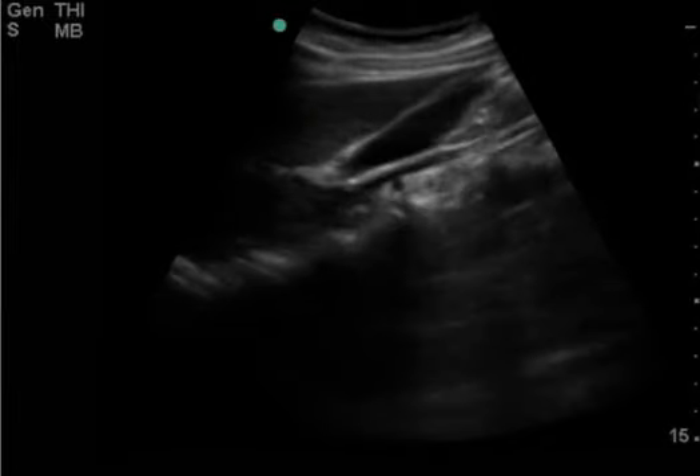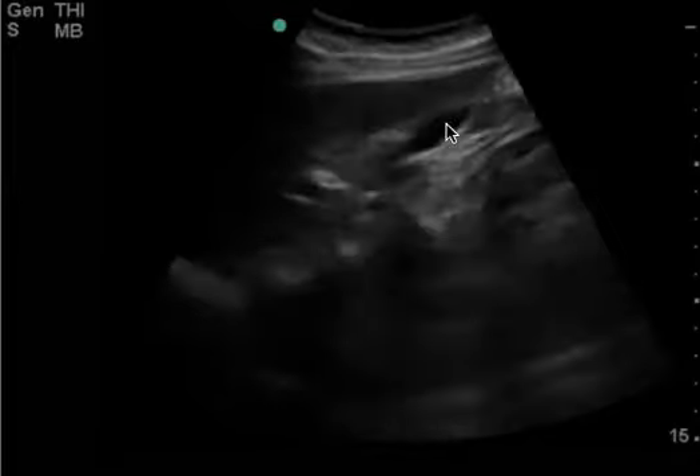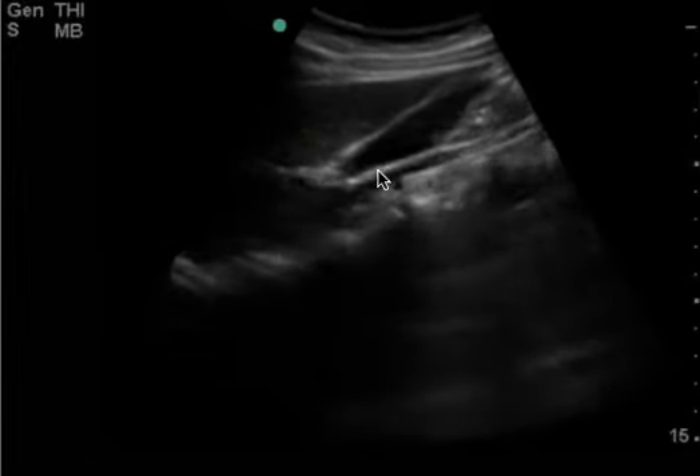This is a right upper quadrant ultrasound. This is kind of a nitpicky video because you can see everything you need to see. This is the organ in question — this is your gallbladder. And this is your IVC right there.